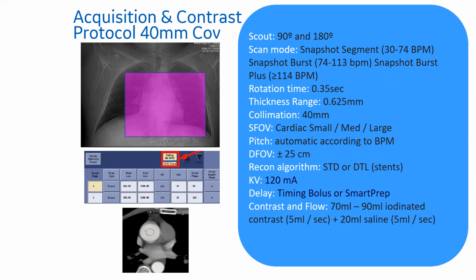If you want to take a picture of this cardiac protocol recommendation, feel free to do that. Well, when we did the survey at the beginning of the webinar, I saw a lot of customers having this type of configuration, which most of them are using 64 slice scanners. So this would be very useful for the users right now, right?